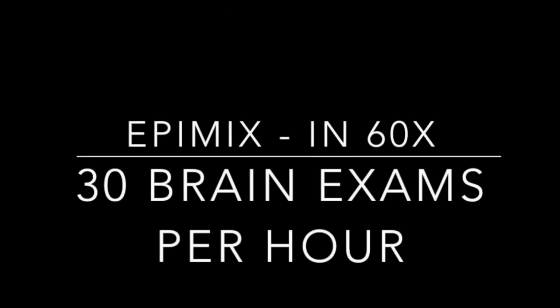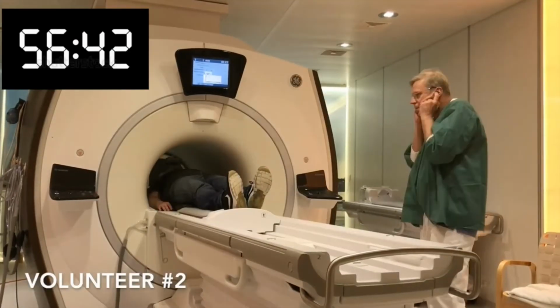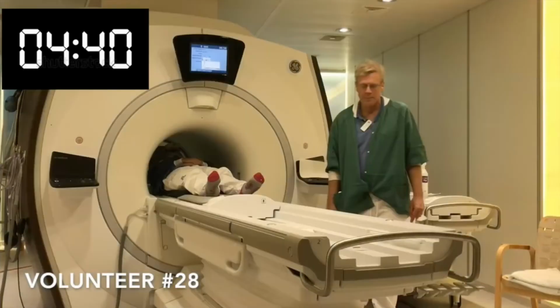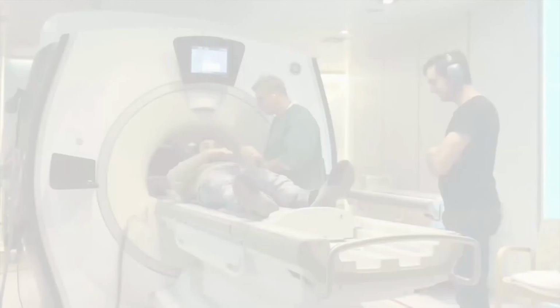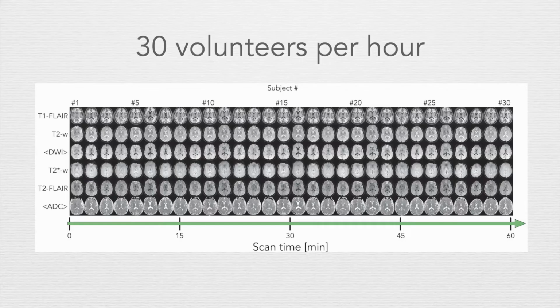And here I'm showing the test we did to see how many volunteers we can put in an MRI scanner in an hour. As you see here, the bed is going in and out, and we change the volunteer while the bed is still in motion. And we registered a new exam, and we also cleaned the mattress between every fake patient, or volunteer. This is obviously just for showing the extreme, and there's no way that a patient would accept this.